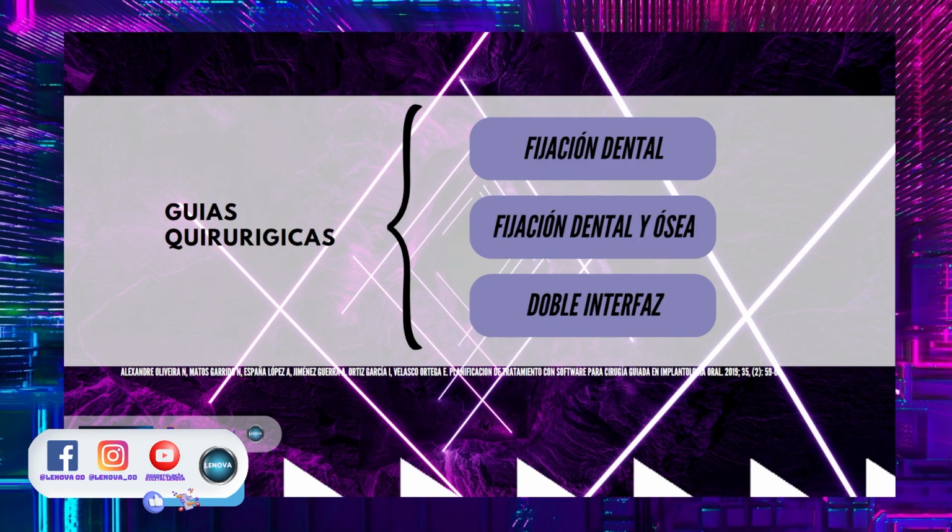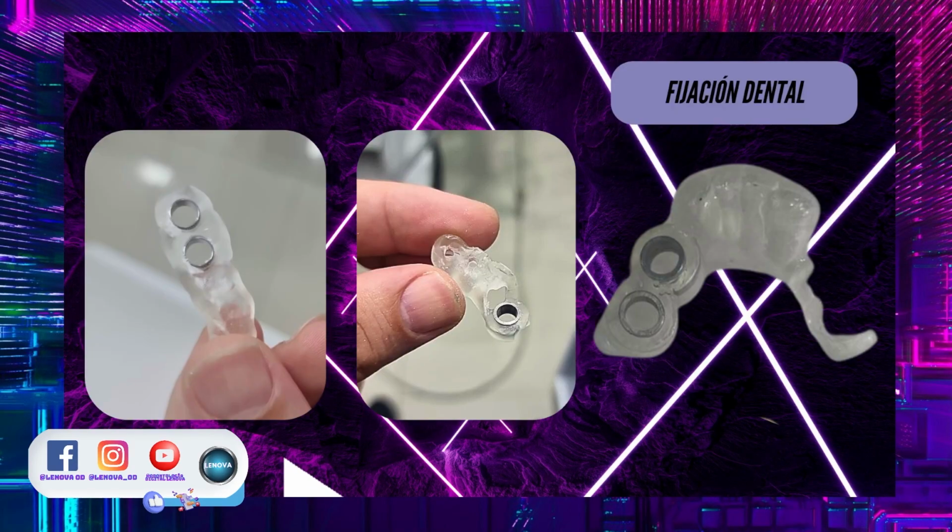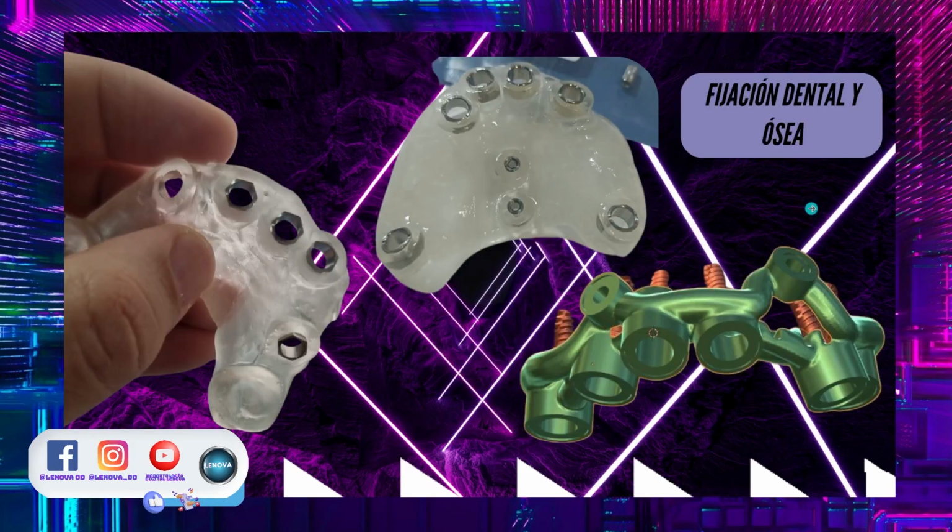So what you are seeing on the screen is a dental fixation guide where we only use teeth, but we are not using any fixation pin. Here we are referring to what are dental fixation or support guides. We will have a second level, which I personally find a bit more complex, because we will have to use both dental fixation guides and bone fixation guides.